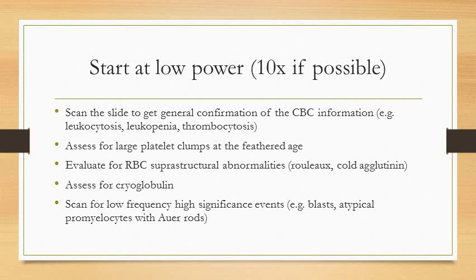So once again, you're trying to stop yourself from jumping to conclusions. You can start at a low power, 10x if possible. Scan the slide to get general confirmation of the CBC information. For example, if the white count was really high in the paperwork, make sure that it looks the same way when you're looking at low power on the slide.